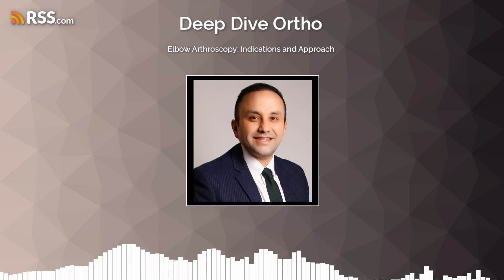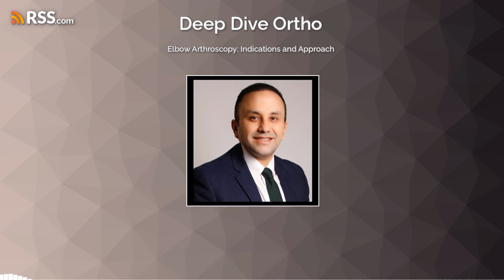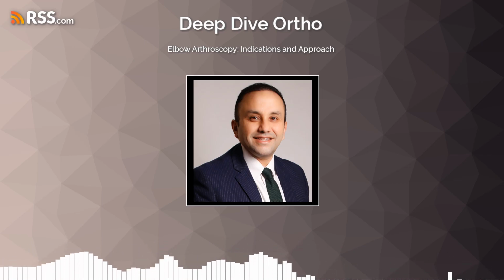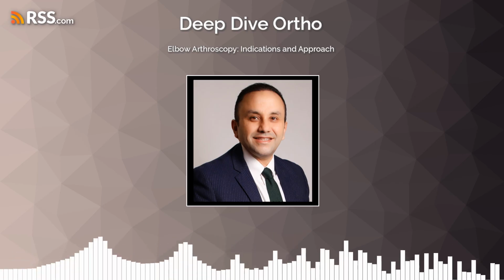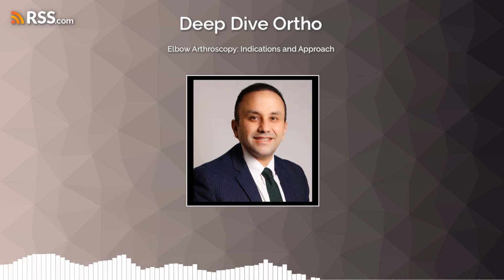Absolutely. Arthroscopic surgery is now widely recommended as the first-line treatment for OCD. Open procedures are generally reserved for cases where arthroscopy has been attempted and failed. The beauty of the arthroscopic approach is its proven track record. Excellent results, high patient satisfaction, and critically, no progressive loss of motion in reported series.